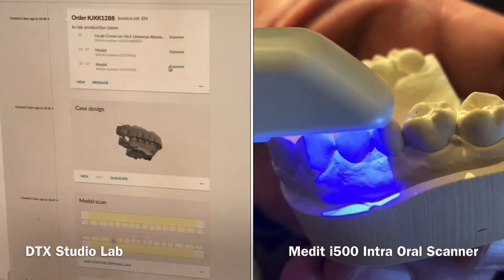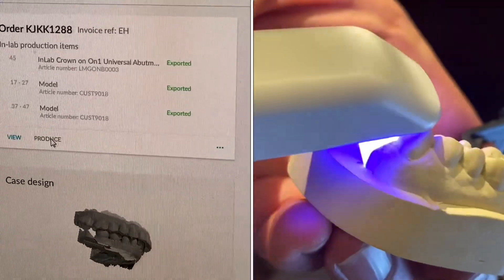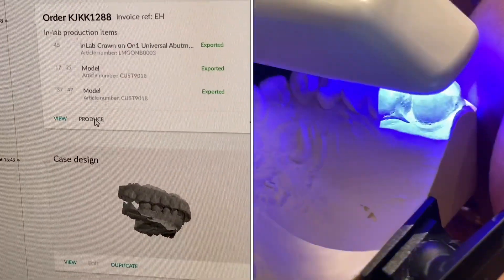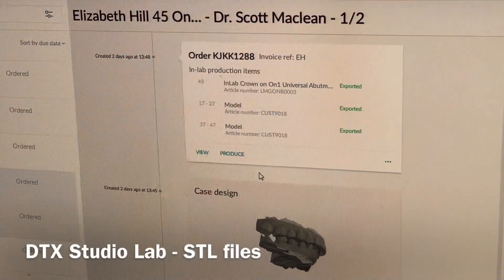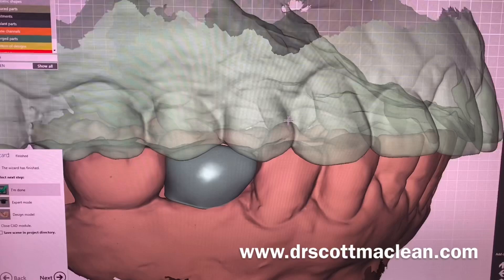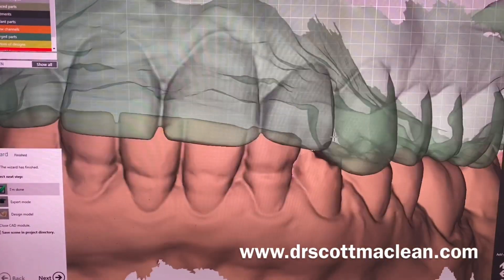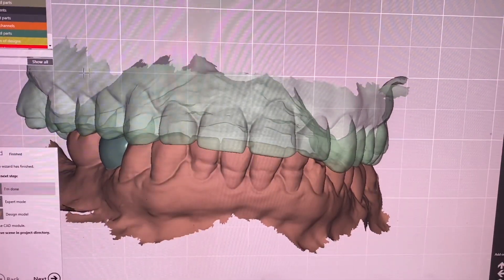With the digital workflow you're going to use some software. You'll use an intraoral scanner or a lab desktop scanner and send it to the lab technician. Many dental offices will actually be doing this themselves - making templates and printing them out. You use software like DTX Studio Lab, and you go and design what you want to make. We're taking STL files - these are surface files like casts - and generating something like a dye model for making an implant crown. Here's an STL file that comes in; we can generate an on-one crown, which is an on-one abutment with a zirconia crown on top.